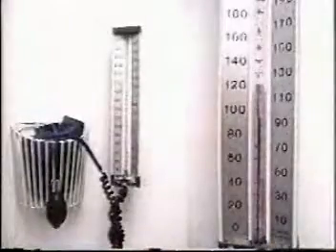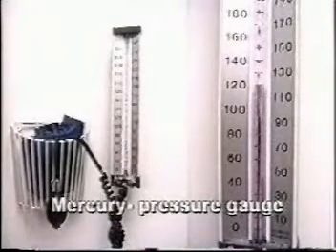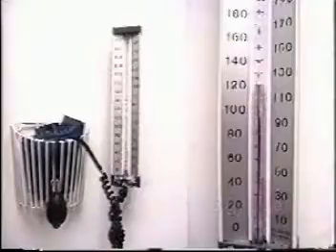There's another type that you'll see there that's a mercury type of pressure gauge. It is a rectangular column. It's not used nearly as much as it used to be because of the possibility of this breaking and causing a mercury spill. And you may have remembered from previous discussions, mercury is a very toxic metal and can cause lots of problems not only to our environment but to individuals as well.